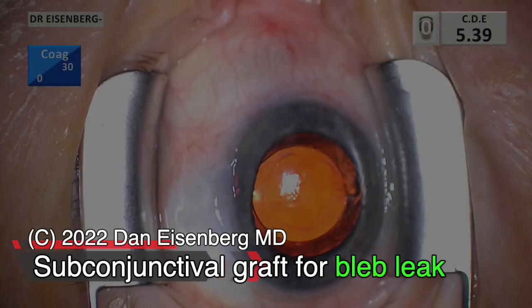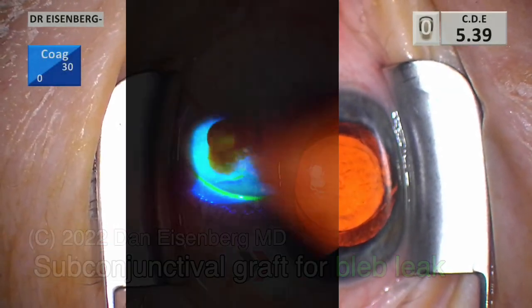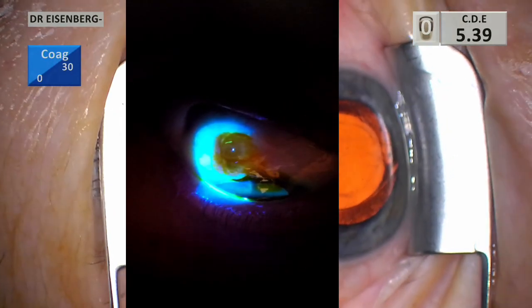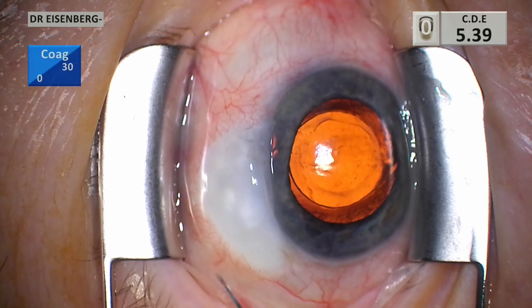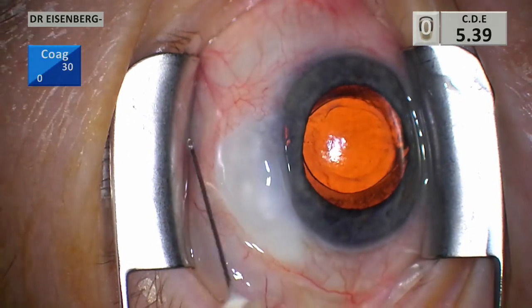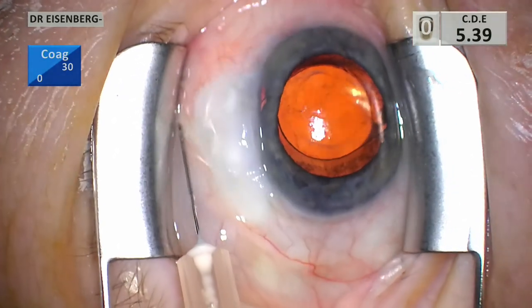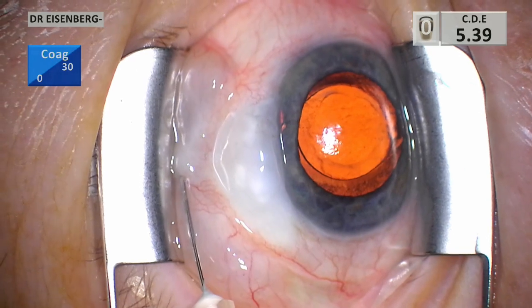Welcome everybody. This is a technique for fixing a bleb leak without destroying the bleb and without ruining the pressure. Here's the clinical appearance of our leak — it's one of the unfortunate effects of a bleb: they either scar down or eventually thin out and leak.